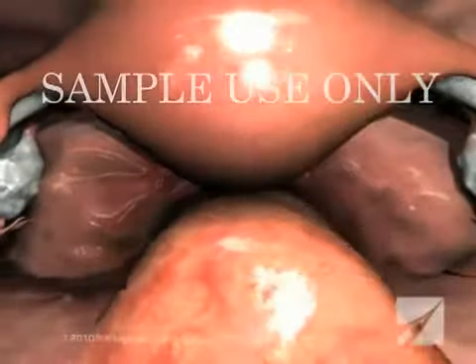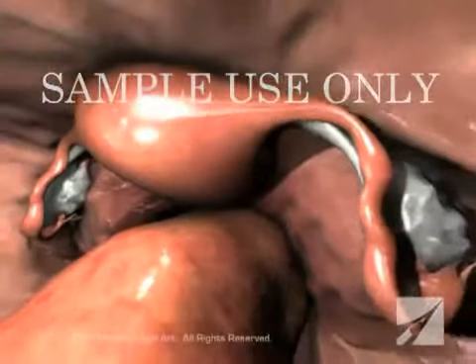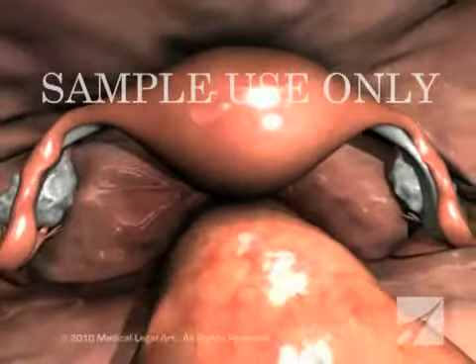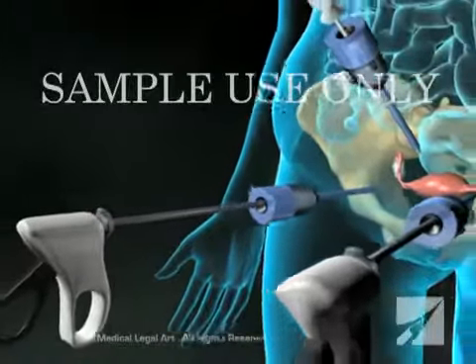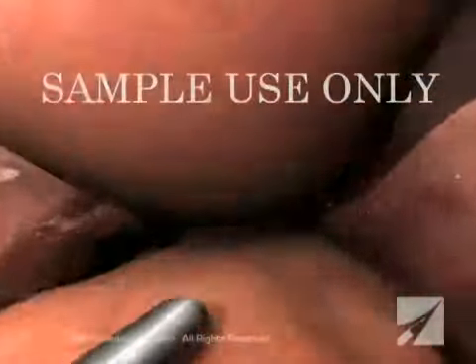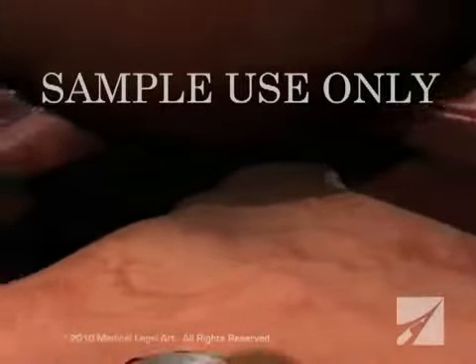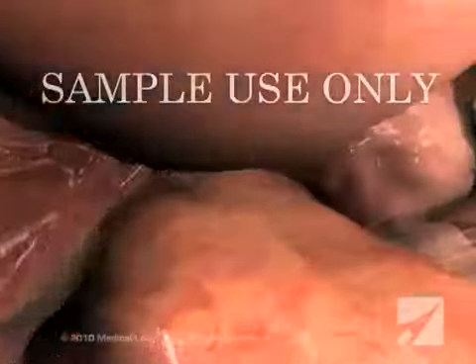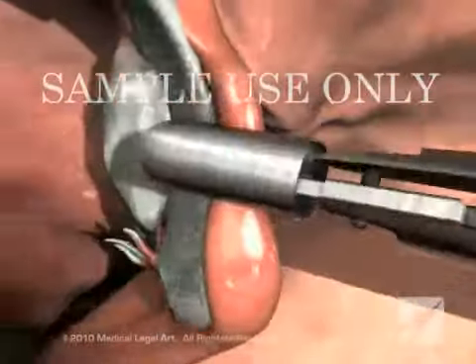Your surgeon will carefully examine your pelvic organs and tissues, looking for signs of disease that might explain your symptoms. He or she may create other ports through which instruments can be slipped. These additional instruments are used to move organs out of the way for better viewing or to perform operative procedures such as removing scar tissue, taking biopsies, or draining abnormal fluid.